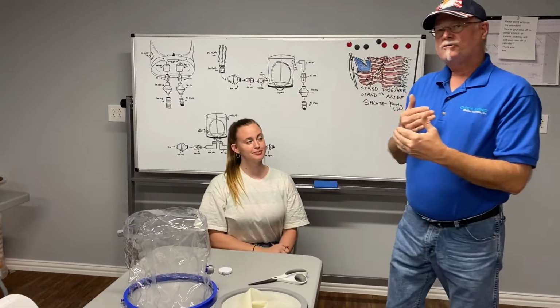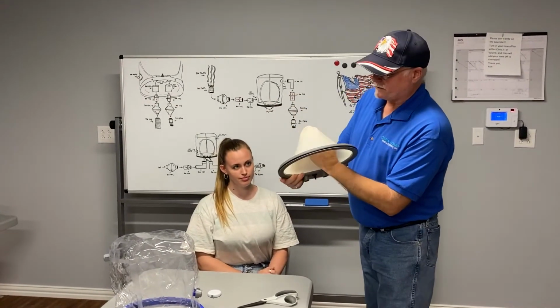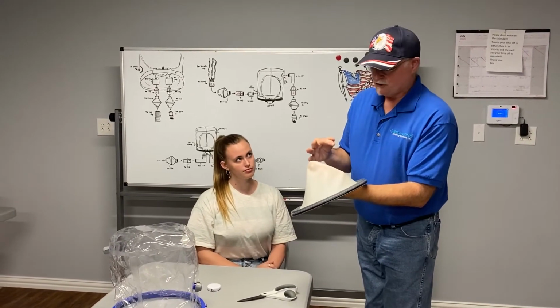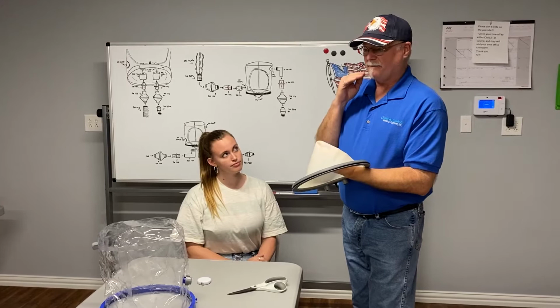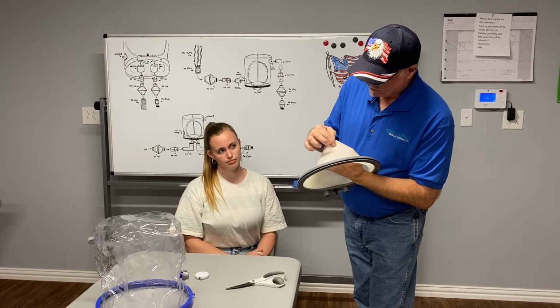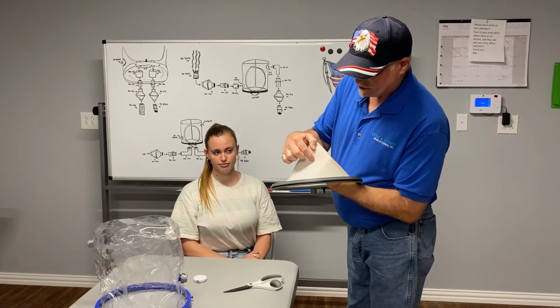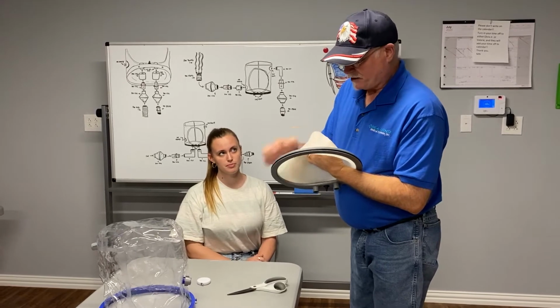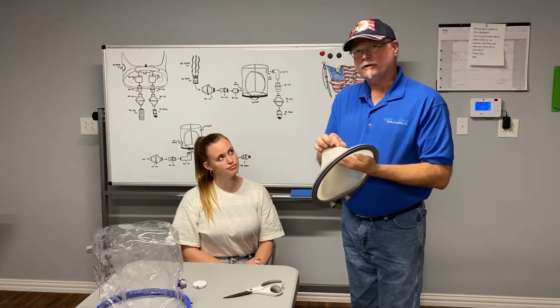When you get your instruction sheet, it will show you the definition of each one of these rings. They're probably going to be hard to see on video, but each one is measured on that instruction sheet. For a 13 1/4, I know there's a line between 13 and 14 3/4. That's going to be the fifth line: 1, 2, 3, 4, 5. Because it's in the middle of the range, I'm going to cut between these two lines, approximately. So we're going to pause, we'll cut this, and then we'll install the hood.